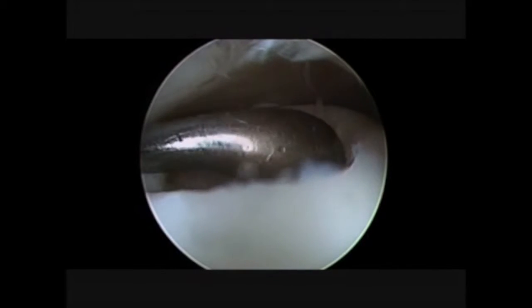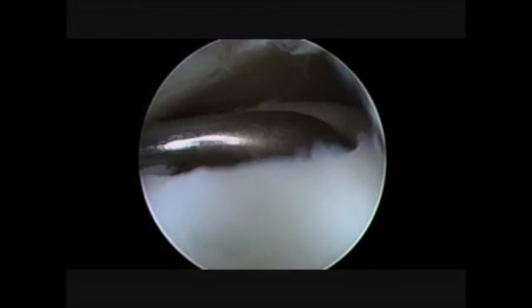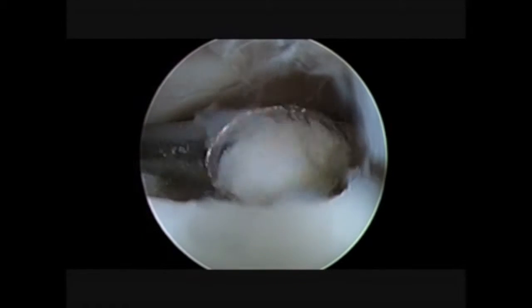As you can see, we are not happy with the posterior stability, so we come back with a curette in order to achieve the perfect stability of the shoulders.